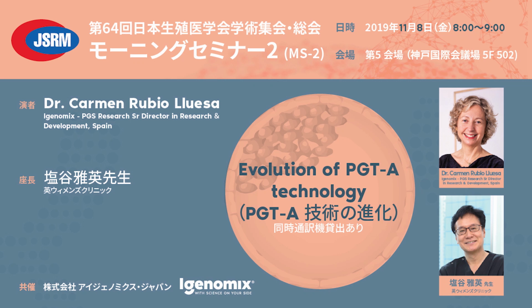I am very impressed by your latest information, especially the concordance of the spent media superior to trophectoderm biopsy, right? So my question is, do you need assisted hatching or not? A recent publication mentioned that assisted hatching is not needed or is not recommendable due to the laser damage. How do you think? Our approach is without assisted hatching. I agree, without touching the embryo at all. So just growing the embryo in the IVF lab and collecting the media without assisted hatching.